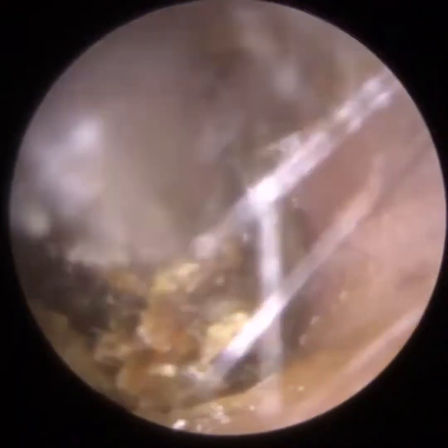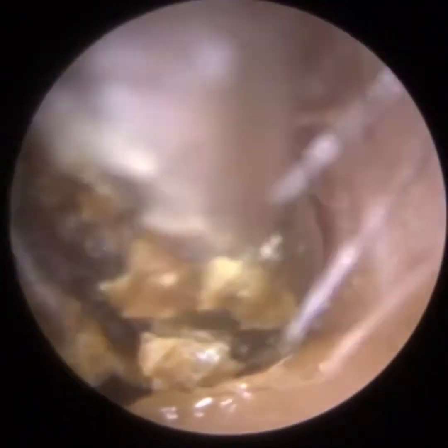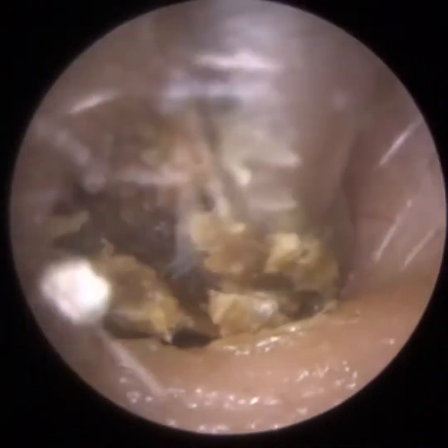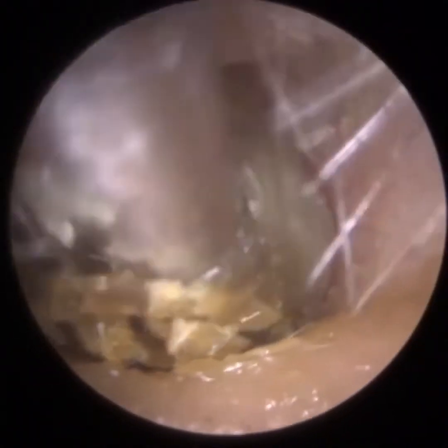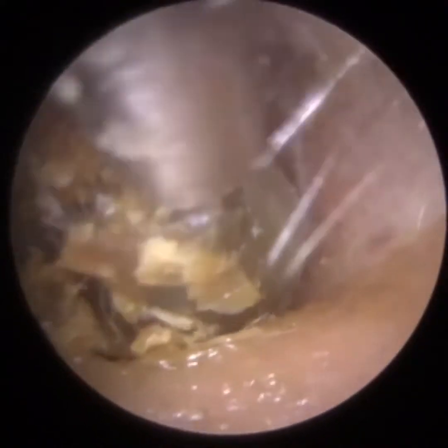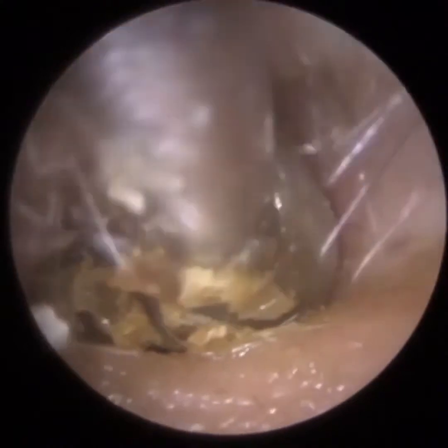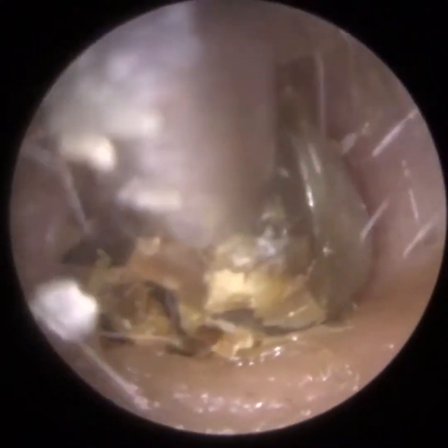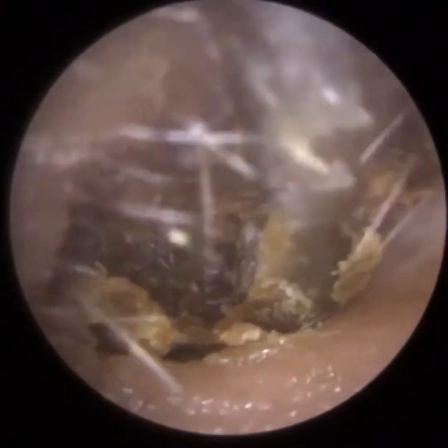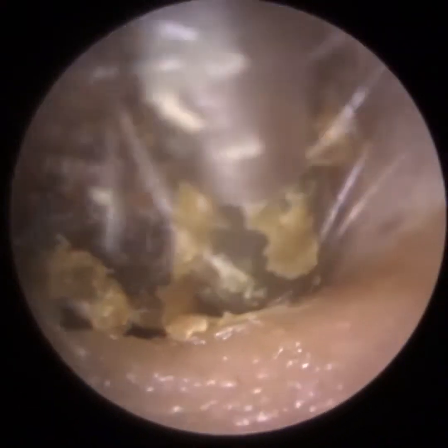Now, with a patient who's quite anxious, wherever possible, you want to avoid using ear hooks and Jobson Horne probes or forceps very deep in the ear, in the sensitive inner two thirds of the medial canal wall, which is the bony part, which is the sensitive part. You just want to avoid contact with the canal wall wherever possible. So again, I'm just using suction, and I'm just wriggling this wax.